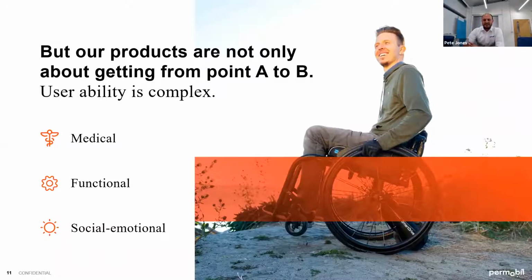For some of these, it will be vitally important that they are comfortable for these years. For example, somebody with cerebral palsy, the average age of diagnosis is 0 years, and they could be spending on average up to 40 years in the power wheelchair.